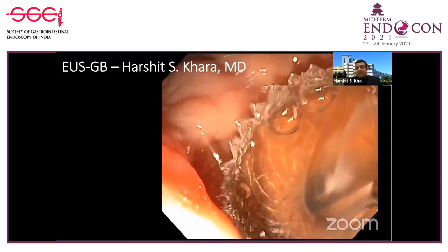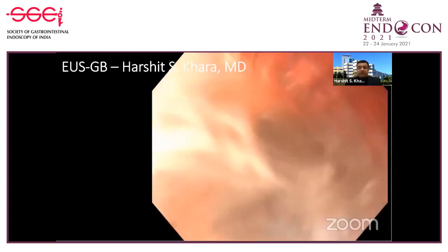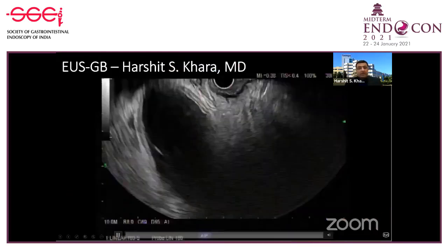In my personal experience, I usually end up dilating the tract of the gallbladder in the same session to provide significant decompression of the gallbladder immediately. And as you can see, the reward is very satisfying with drainage of purulent material, and gallstones can be lavaged out, thus decompressing the patient's cholecystitis.